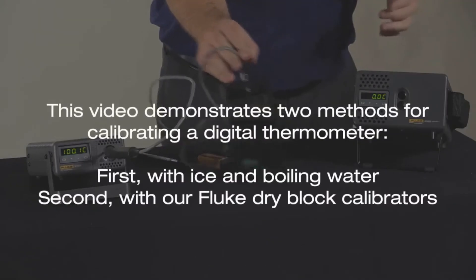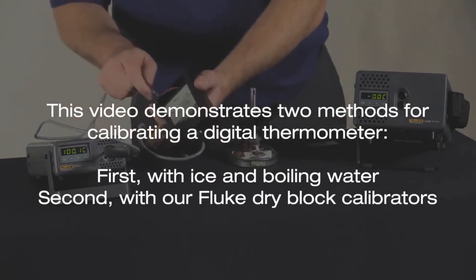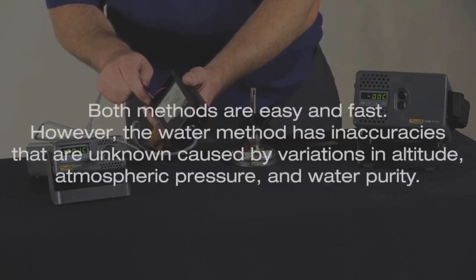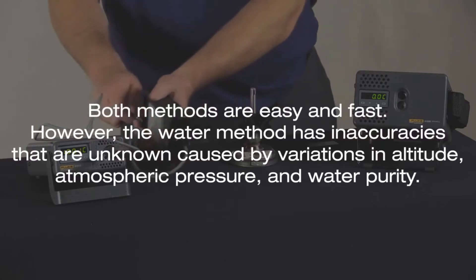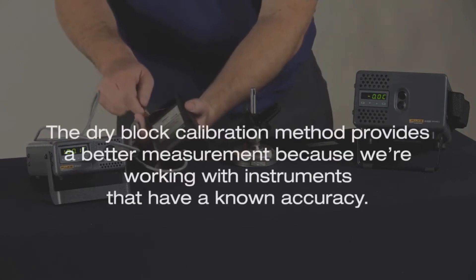This video demonstrates two methods for calibrating a digital thermometer: first with ice and boiling water, and second with our Fluke dry block calibrators. Both methods are easy and fast. However, the water method has unknown inaccuracies caused by variations in altitude, atmospheric pressure, and water purity. The dry block calibration method provides a better measurement because we're working with instruments that have a known accuracy.